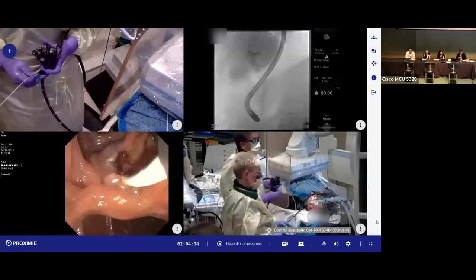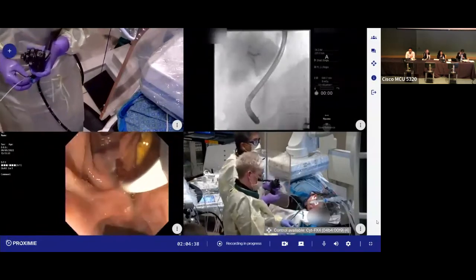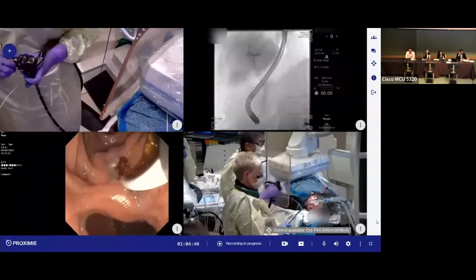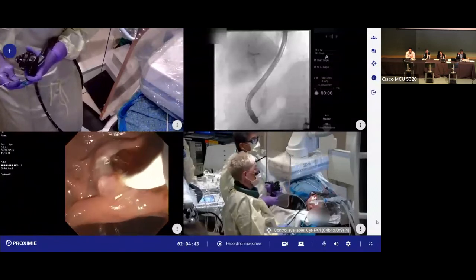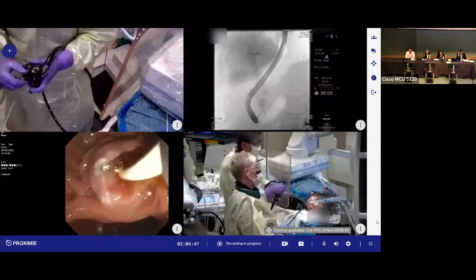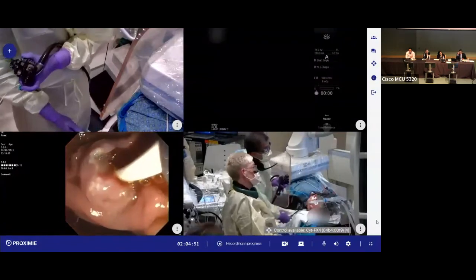Well, let me show you here in a second. So we'll go to 9 here. I didn't forget the cannulation question, but I just wanted to show this. So we're at 9, and it may not get much, but the maneuver is going to be unlocking your dials. You want the tip of the duodenoscope to be parallel to the bile duct axis.